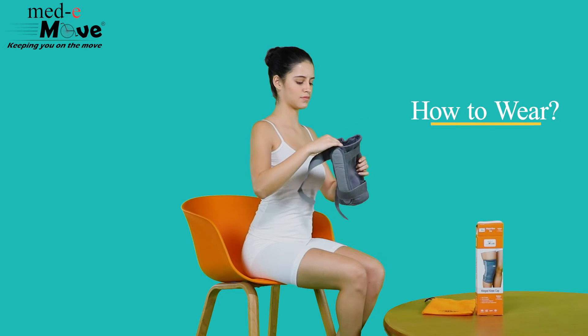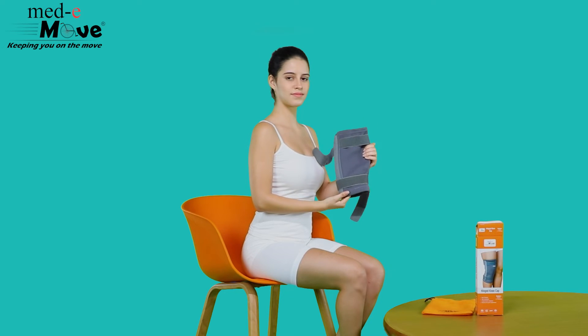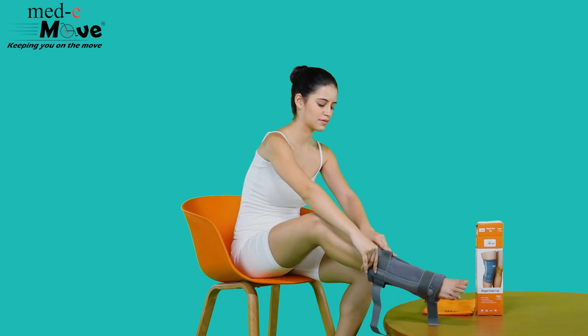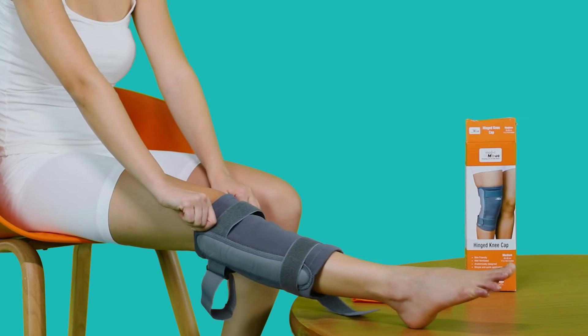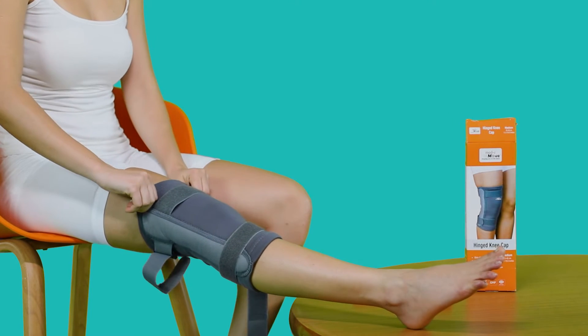Now let us see how to wear the Medimove hinged kneecap. The hinged kneecap is to be worn with the broader side upwards by slowly pulling it towards your mid-thigh. Ensure the hinges are on the side, allowing the knees to bend comfortably.